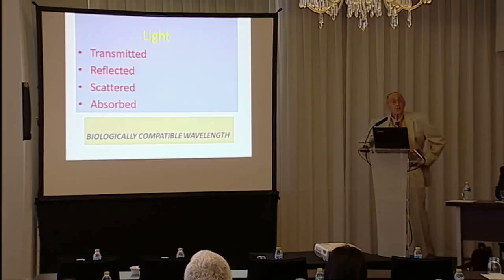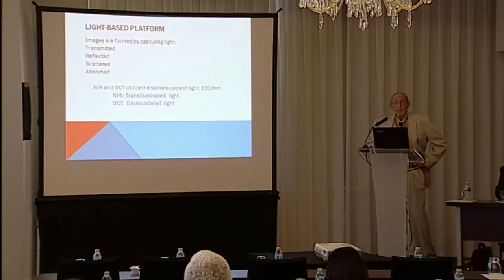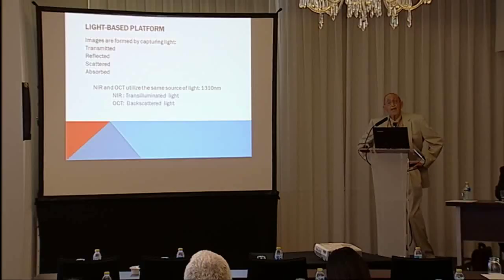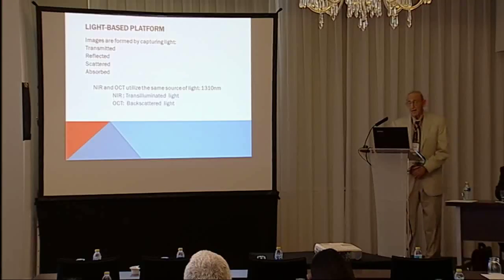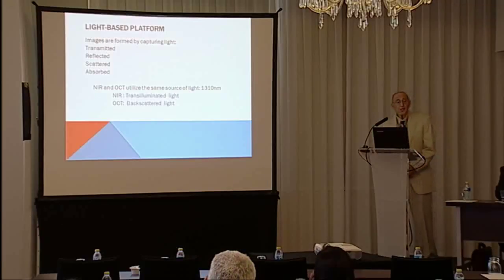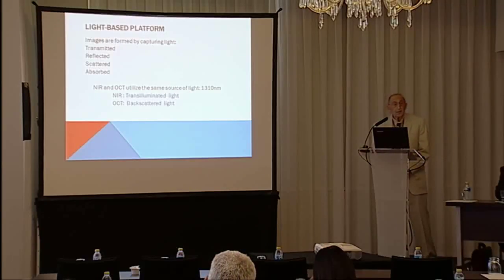Light is transmitted, reflected, scattered, absorbed, at a biologically compatible wavelength. It's a light-based platform. Images are formed by capturing light. It's transmitted, reflected, scattered, absorbed. NIRI and OCT utilize the same source of light, 1310 nanometers. NIRI is transmitted light, OCT is backscattered light.